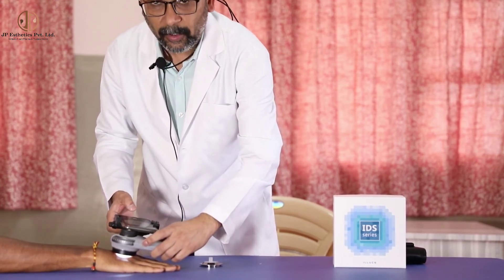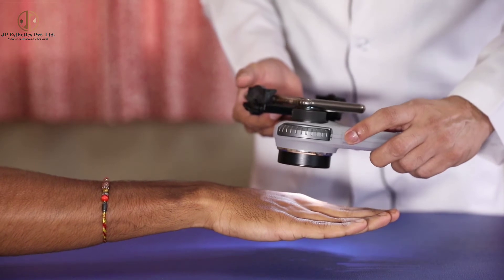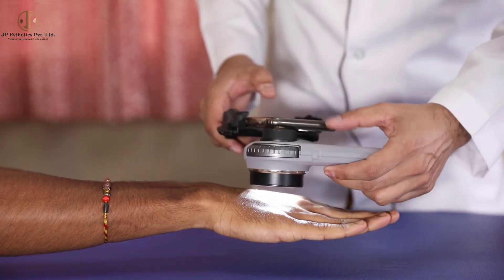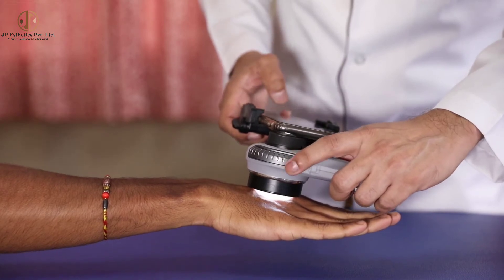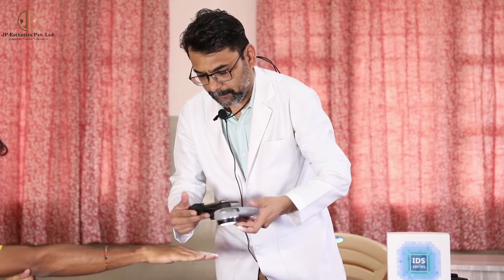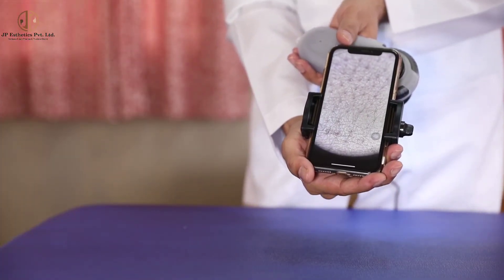Now I will show you an example. This is the polarized and non-polarized mode. Now I am clicking with non-polarized mode. I will show you how to take images in the smartphone. I am going to take a non-polarized mode image — this is the button where we can change from polarized to non-polarized. Now I am capturing the image. This is how the non-polarized mode will appear on the phone.